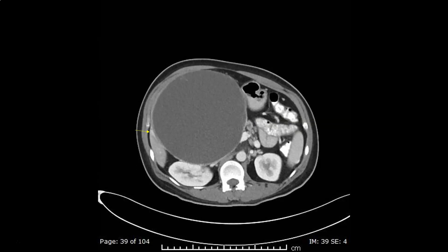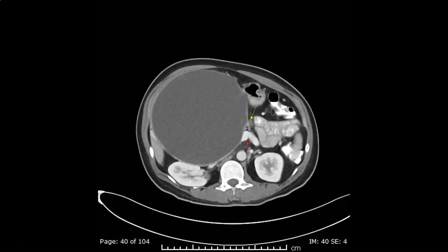We still see the duodenum. Here is the confluence of the superior mesenteric vein and the splenic vein to form the portal vein, displaced to the left by the lesion, pointed to by the red arrow. The yellow arrow shows the pancreatic body as it comes in direct relation to the left side of the lesion.